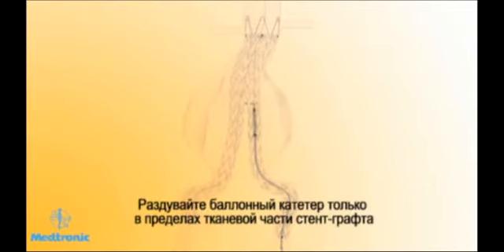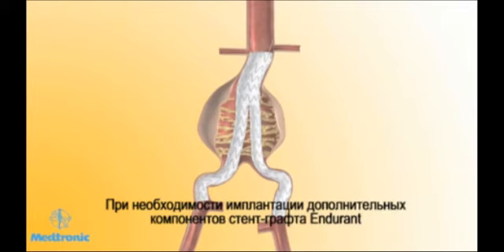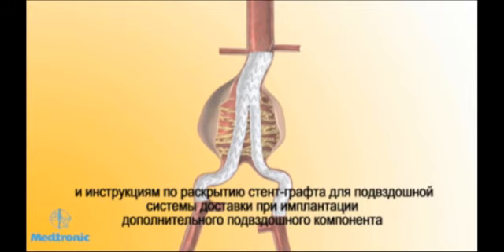Be careful to inflate the balloon only within the covered portion of the stent graft material. Deflate the balloon and repeat inflations and deflations as required within the covered stent graft material. Remove the Reliant balloon catheter from the patient when balloon modeling is complete. If other stent graft components are needed to complete a procedure, please follow the deployment steps for the Endurant aortic delivery system for aortic extension, abdominal tube, and AUI components, and deployment steps for the Endurant iliac delivery system for the iliac extension component.